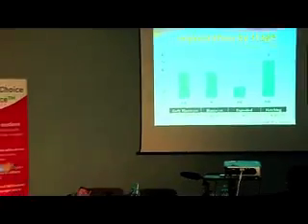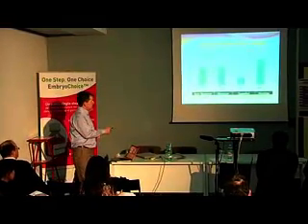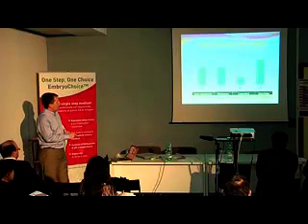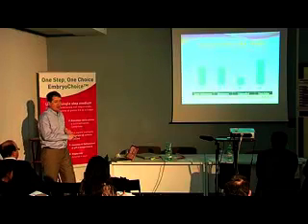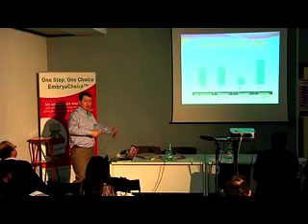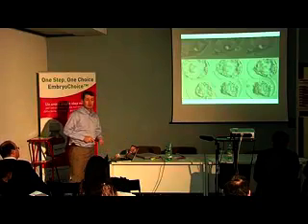But when we looked at this data, what we did notice was that embryos that were at more advanced stages, specifically this expanded blastocyst stage here, didn't implant very well. And we wondered, what is it about vitrification that's causing those guys to have about half the implantation rate of regular blastocysts or hatching blastocysts? One of the things that we noticed was that these embryos had big blastocele cavities, and they didn't seem to tolerate the freezing process very well.